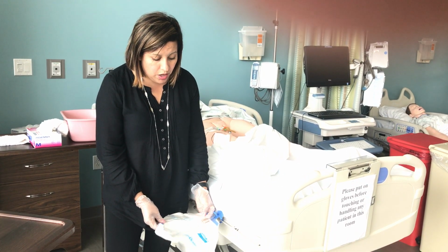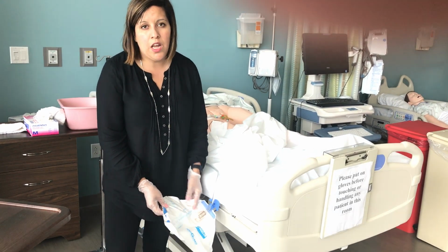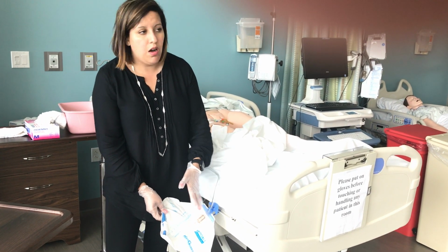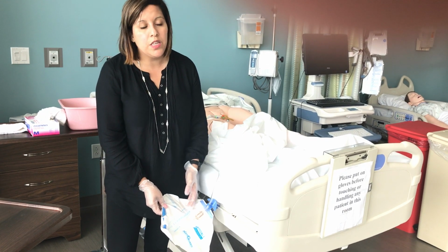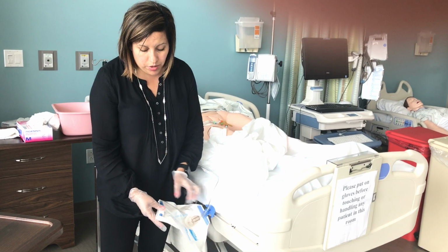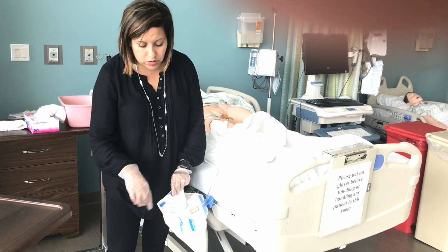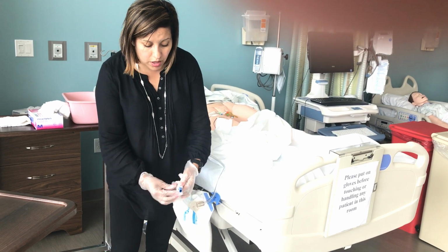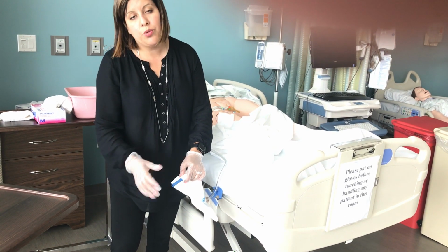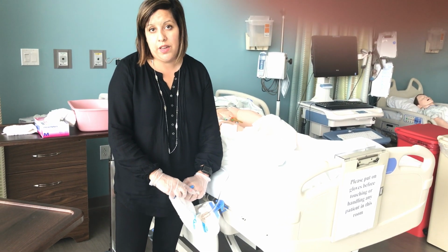Usually you'll be emptying these out per shift. If at any point you see the bag really full, then you definitely need to empty it out sooner. When you empty these out, make sure you use a cylinder. You unclamp it and drain this out into the cylinder, and then you measure it and document accurately.